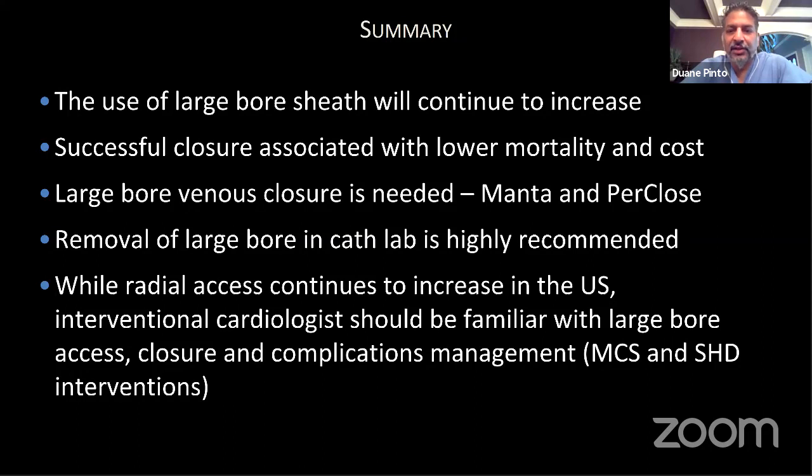Large bore venous closure can be utilized for MitraClip. We didn't describe that or large bore access in that regard. Again, I suggest that we remove these things in the cath lab. And while we're radial first for diagnostic angio and for PCI, I think we should be well versed in these types of access techniques. And with that, I'll stop and take any questions.